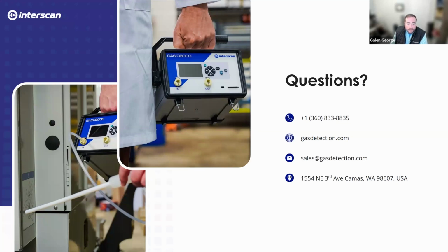And then also for the ethylene oxide sensors, what is the response time for your electrochemical sensors? That's a great question. Our T90 is typically under 1 minute. I'd have to look up the exact number, but I can get back to you on that. I know that it's less than a minute for our AccuSafe sensors. For our Gas D8000, it would be even less than the AccuSafe. So that should be totally sufficient for catching leaks quite rapidly.